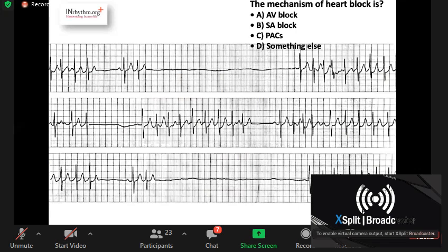Now, this, anybody can say probably. So what is the first part, Neeraj? You can unmute and tell. Sir, atrial fibrillation going on. The first part is atrial fibrillation, correct? Because the RR interval is irregular and you do not have a P wave. Then there is a sinus P wave. Then again, the possible initiation of the flutter, giving rise to again a significant sinus pause, resuming a sinus rate, again, and atrial fibrillation.